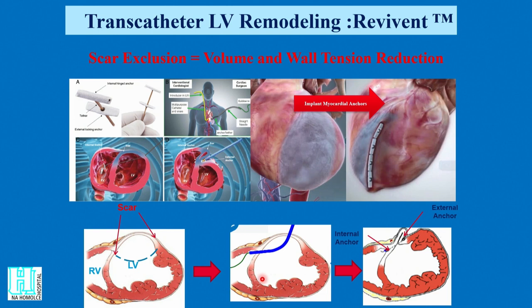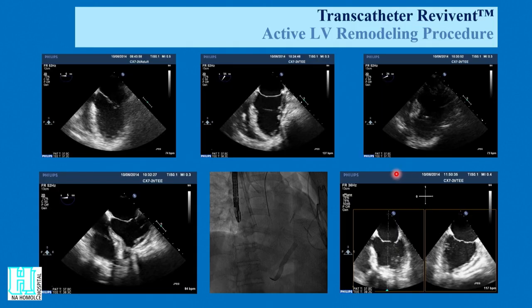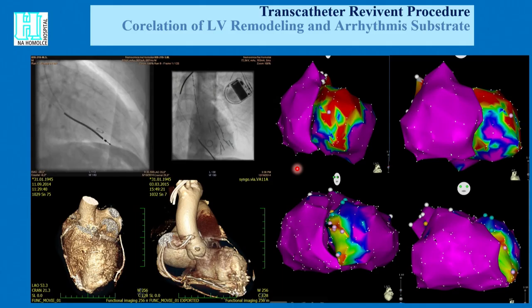But actually, it's your decision how many anchors you create. So you can go with 1, 2, 3 anchors in terms of what you want to lessen. If you want to be effective, it's not working, the movie, so it doesn't matter. So, okay, in principle it's the same. So if you exclude the aneurysm effectively, it means that you can lessen the end systolic volume index. And it's visible here, finally.